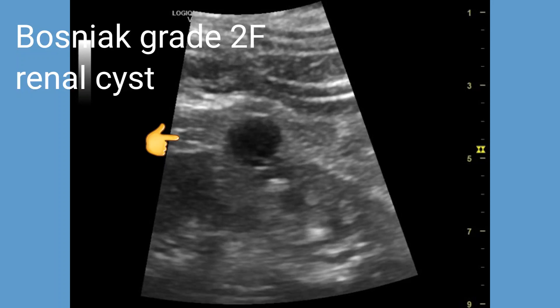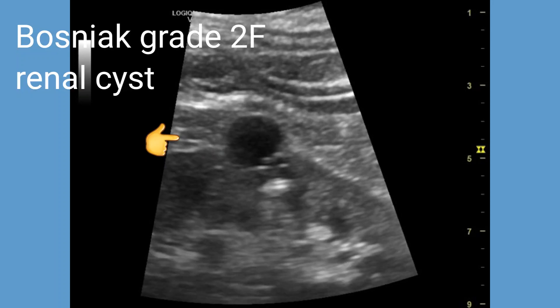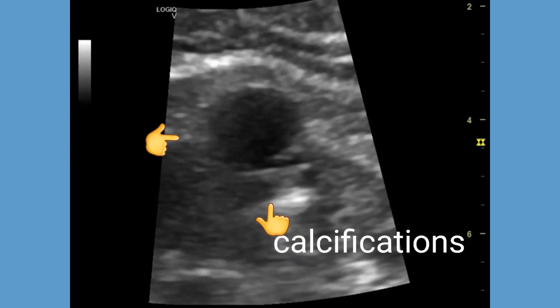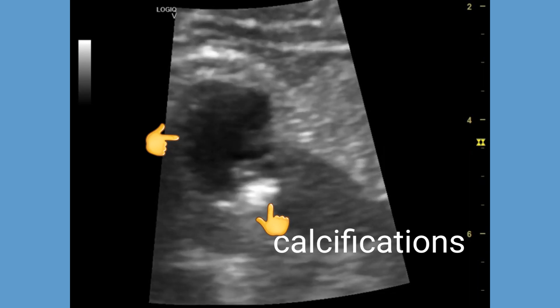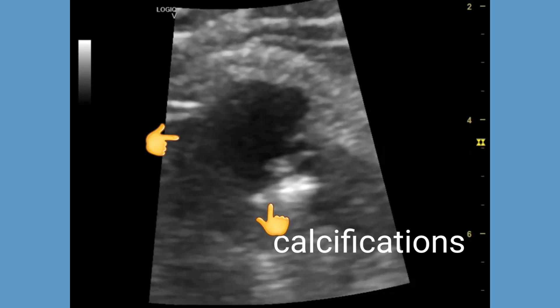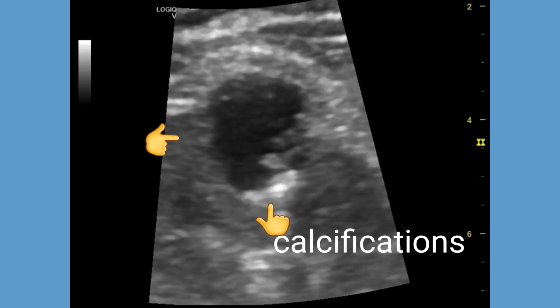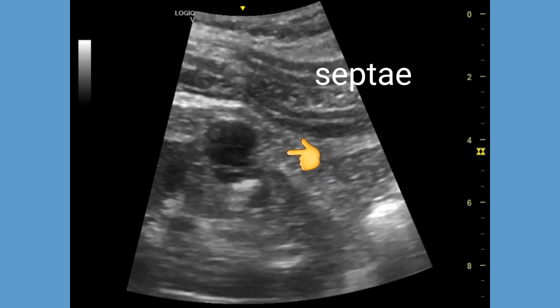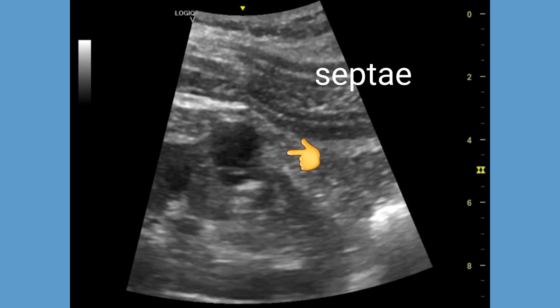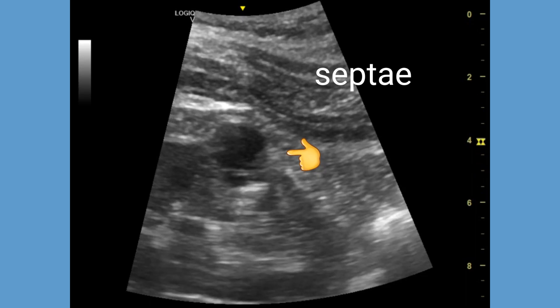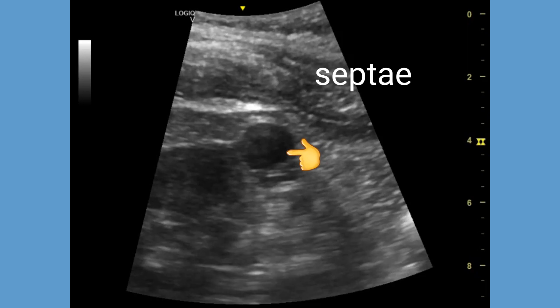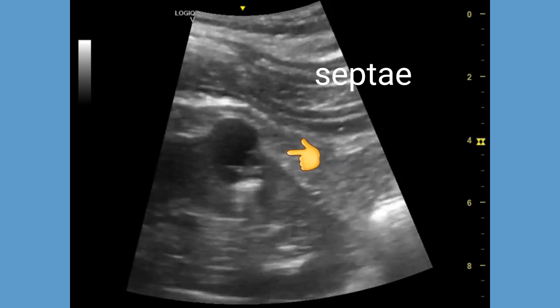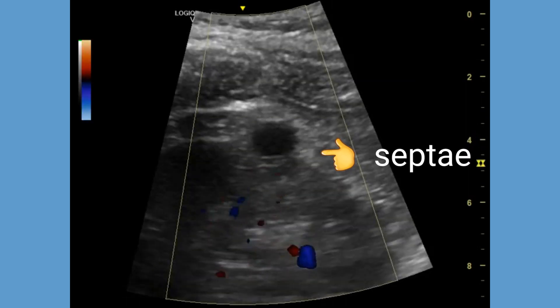In this video, we discuss the case of ultrasound imaging of a Bosniak 2F grade renal cortical cyst. A Bosniak 2F cyst is a renal cystic lesion classified as benign but has some features that make it more complex than a simple cyst, including the presence of thin septae, calcifications, and nodularity. In this case, the cyst is 2 cm in size and has 3 mm nodular calcifications with thin septations. It does not have any internal vascularity on color Doppler ultrasound.